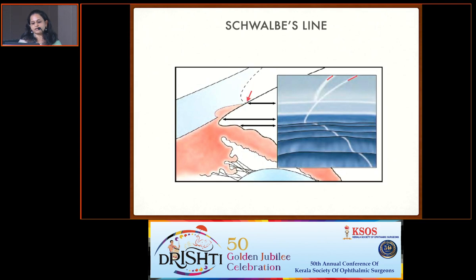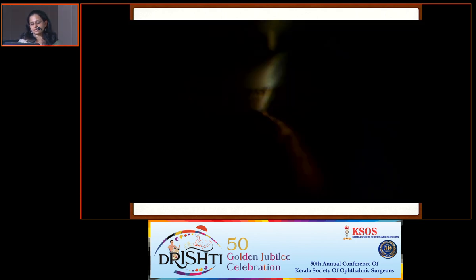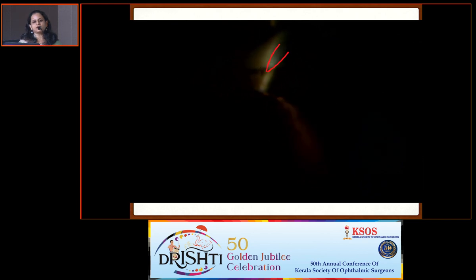You have to do the corneal wedge technique. Corneal wedge technique is nothing but you have to keep a small slit and keep it at an angle of 60 degrees. You can see 2 lines coming from the anterior and the posterior surface of the cornea. These meet together at the Schwalbe's line. So this is an example of the corneal wedge technique. You can see the anterior one and the posterior one joined together at that line. That is the corneal wedge, which corresponds to the Schwalbe's line.